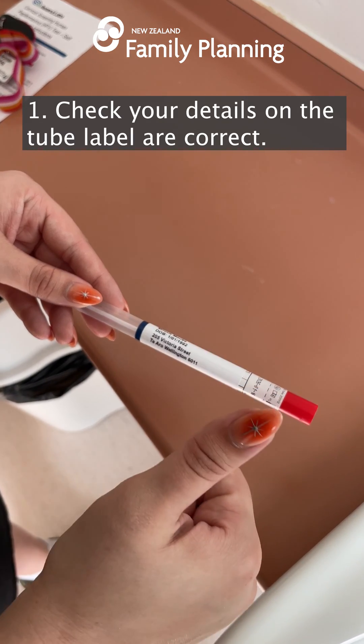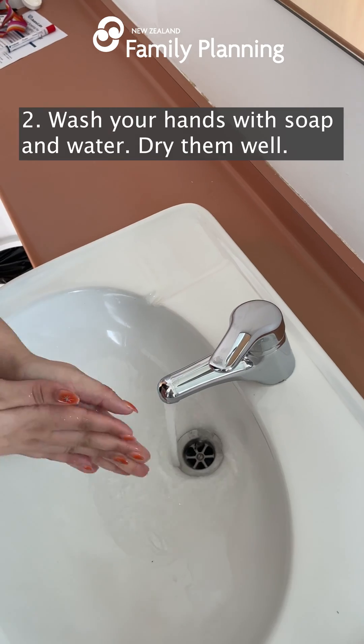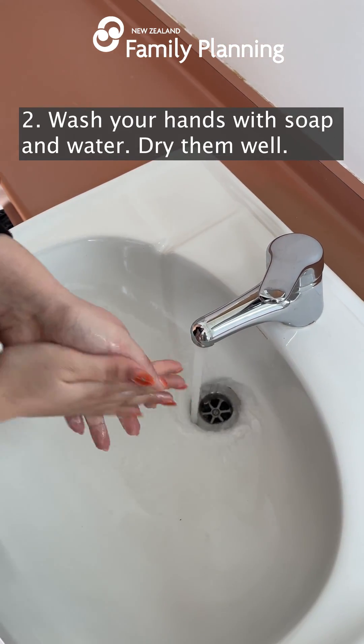Check your details on the tube label are correct. Wash your hands with soap and water and dry them well.